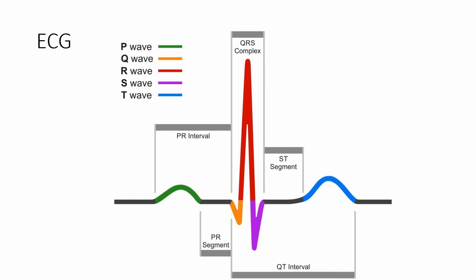I know some of our monitors in our ICU do QT measurements on patients in the ICU. I don't know what it really goes along with. I think it's how long it takes the heart to refill or relax. Is that? Oh, okay.